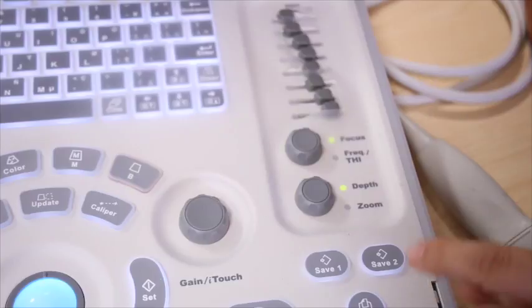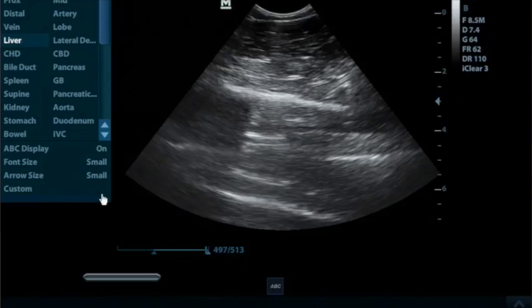You can save images and clips by either hitting Save 1 for an individual still, or Save 2 for the designated cine loops. The length of the cine loop can be changed in the setup screen — please contact one of our account managers on how to do this.